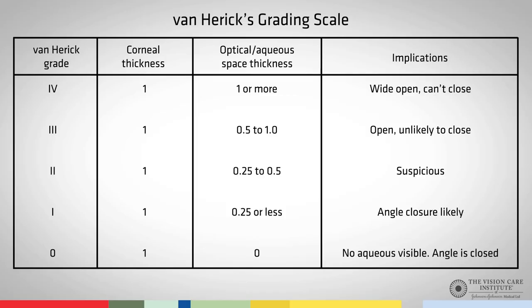In this case, we can see that the optical space is two times greater than the thickness of the cornea. Once we have this assessment, we can refer to the Van Herick grading scale. If the optical space had been between 0.5 and 1 times the thickness of the cornea, this would be assessed as grade 3. In our case, as it was two times the thickness of the cornea, it is classed as grade 4. In both instances, the probability of the angle closing is low.